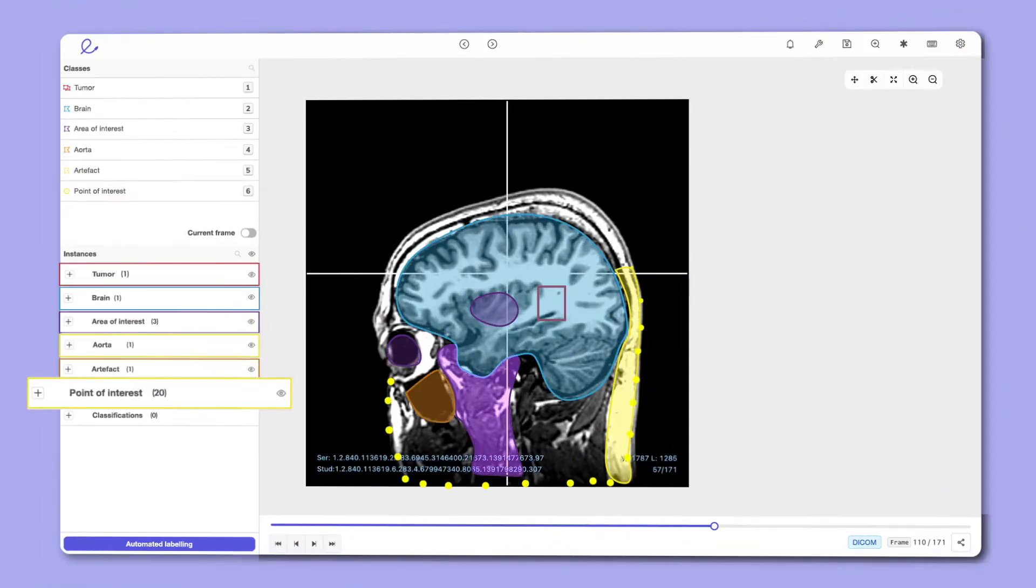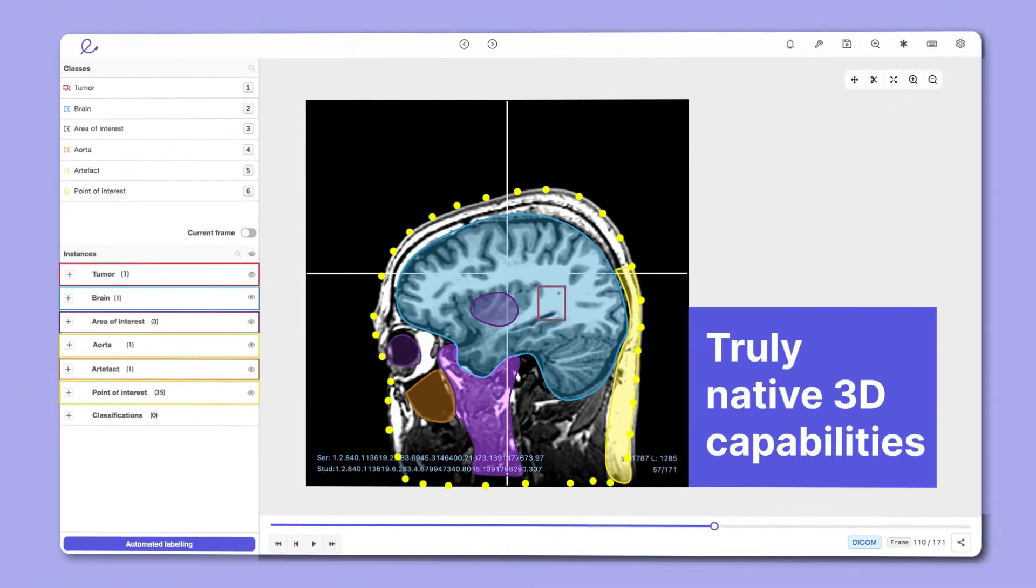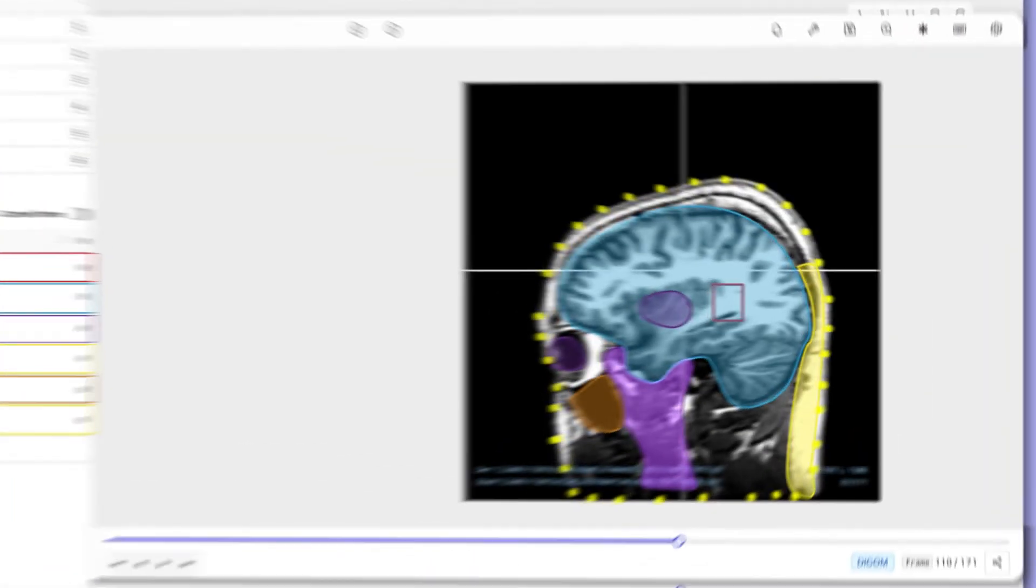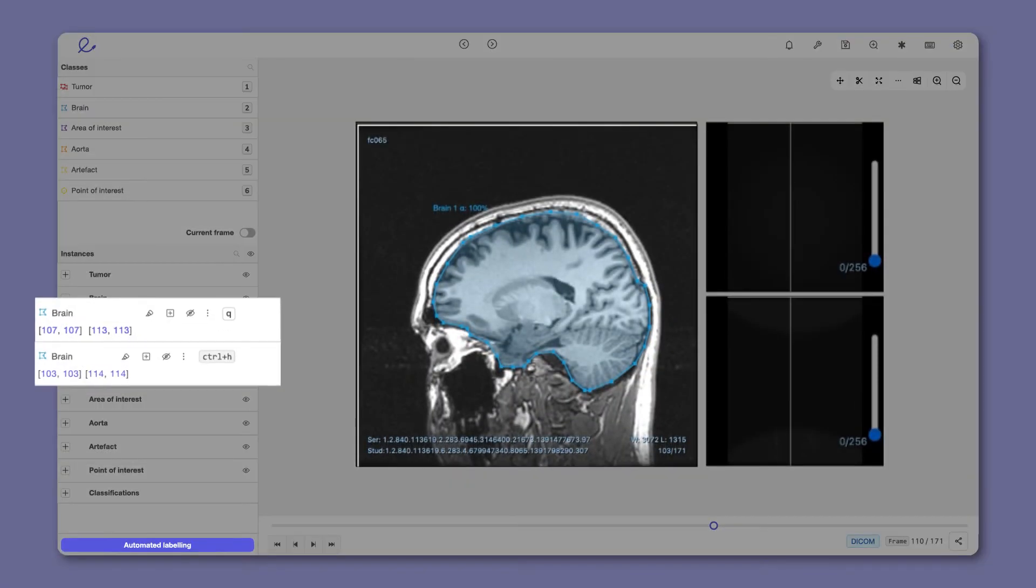It is the first DICOM annotation tool with truly native 3D capabilities. Our tool renders 20,000-plus pixel intensities in browser, supporting hanging protocols.